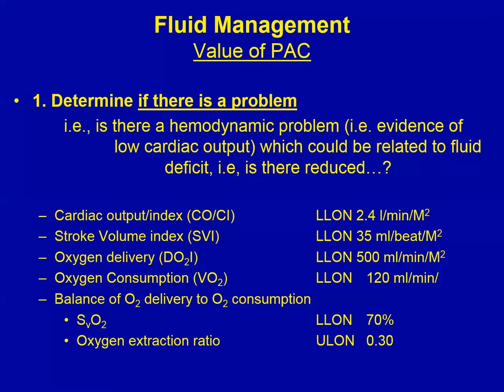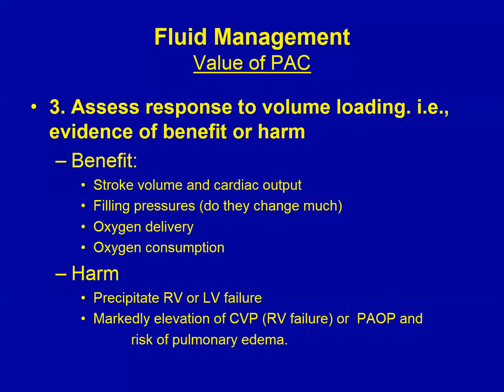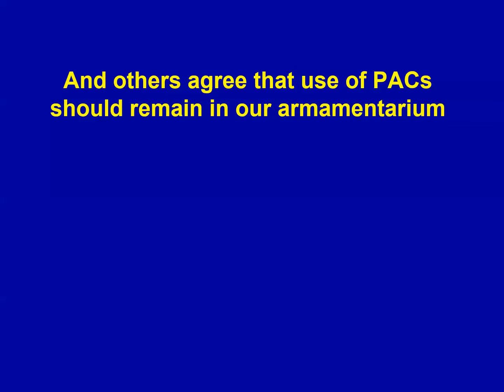It can help determine if there is a problem. It can help identify the pathophysiology of the hemodynamic abnormality. And most importantly, it can help assess the response to volume loading. Is it helping the patient or is it hurting the patient? Furthermore, others agree that the use of pulmonary artery catheters should remain in our armamentarium, as summarized in the next few slides.